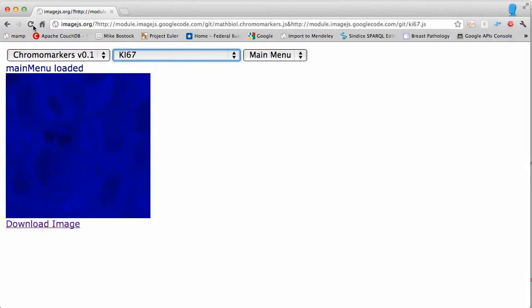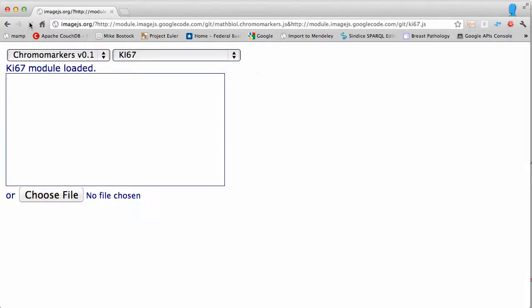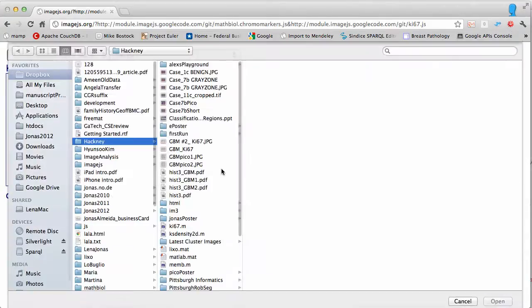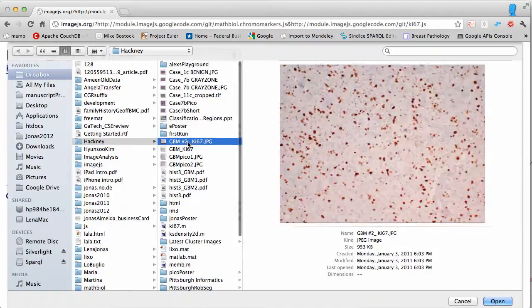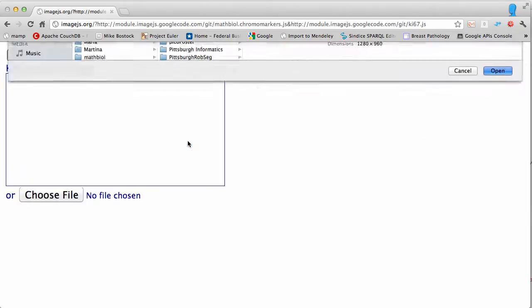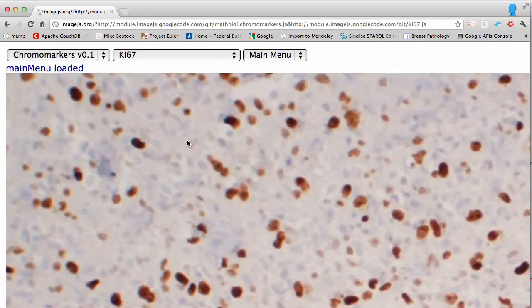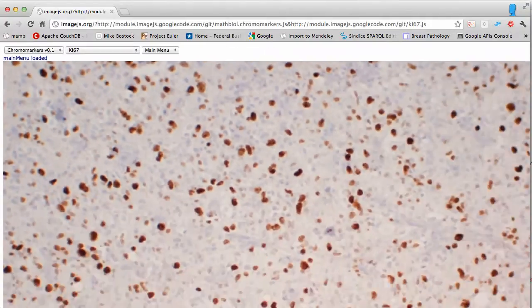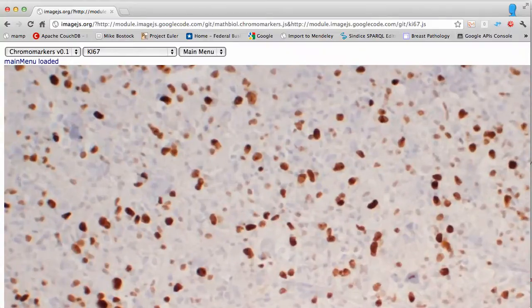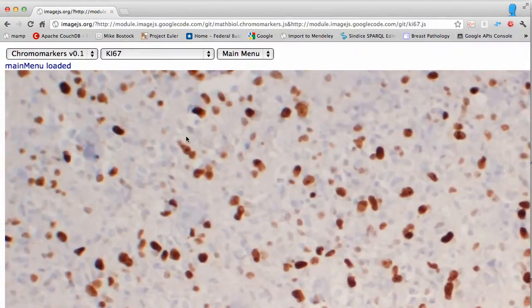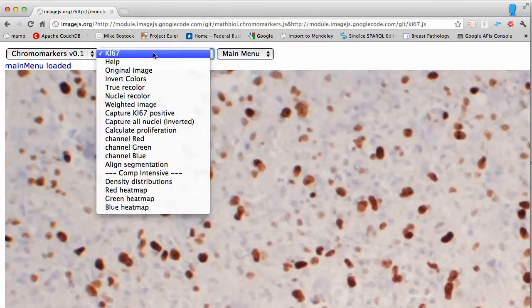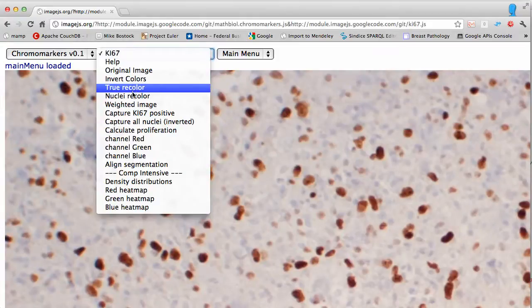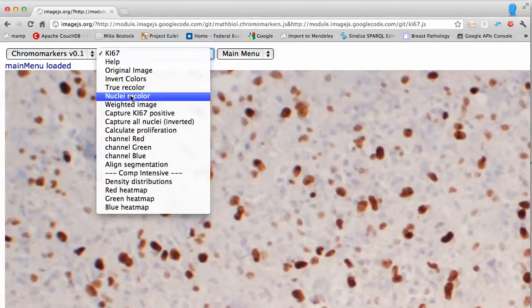You can reload the module to reset it. We'll focus on a specific region so you can see what image analysis processes are doing to the different features. One of the operations developed specifically for ki67 image analysis is the nuclei recolor operation.